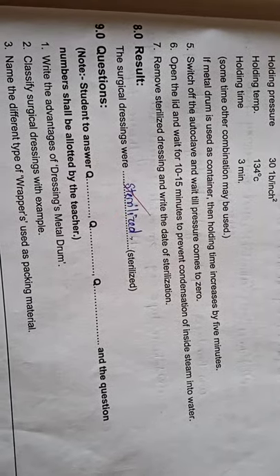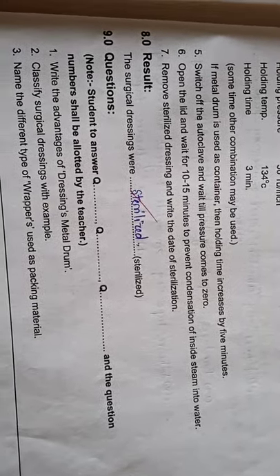Result: the surgical dressings were sterilized. Now I will show you the metal drum container.